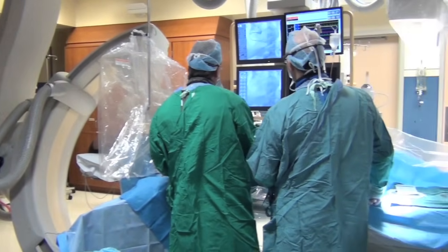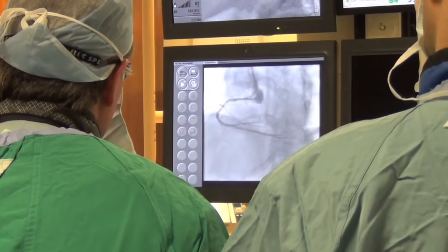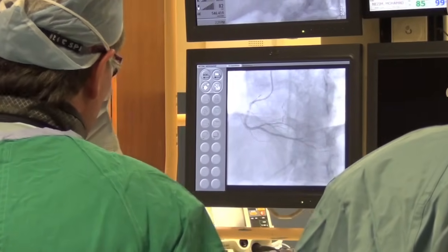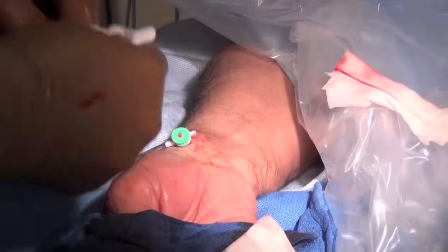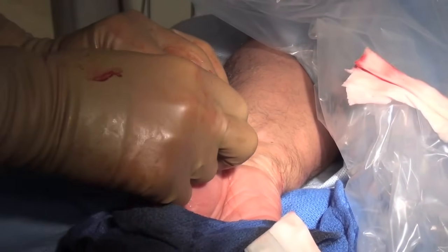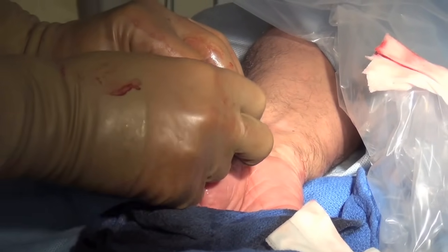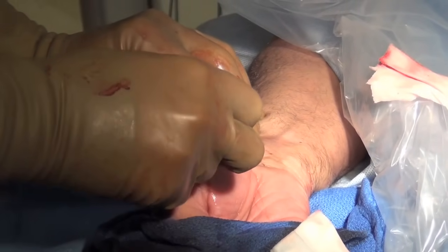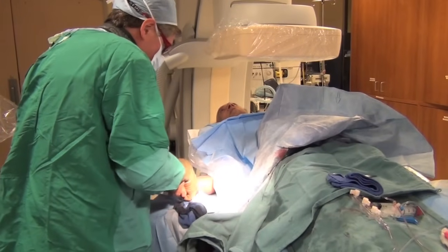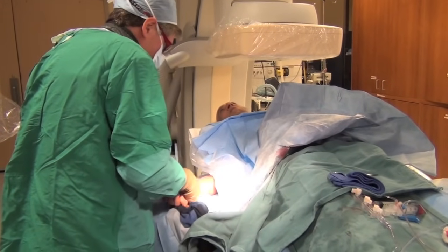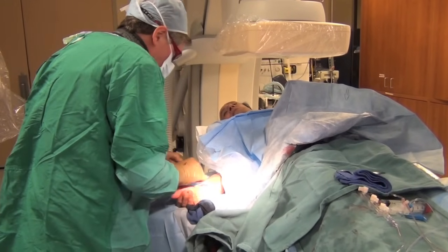At this point, we've completed the procedure. The stents are in place and it might be quite obvious from the images that the artery is now wide open where it was severely narrowed before. We just have to remove the tube — the introducer sheath — from the wrist. We apply pressure over the site until the bleeding stops, and you can see that there really is very little blood loss. The only incision made is about a quarter of an inch in length.